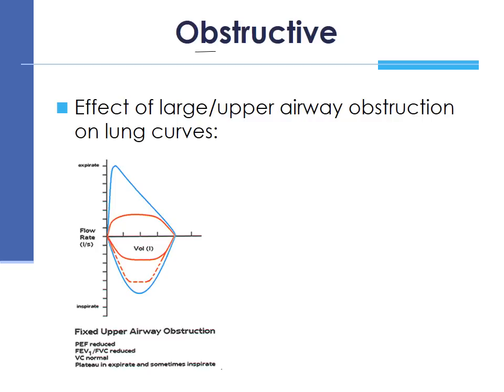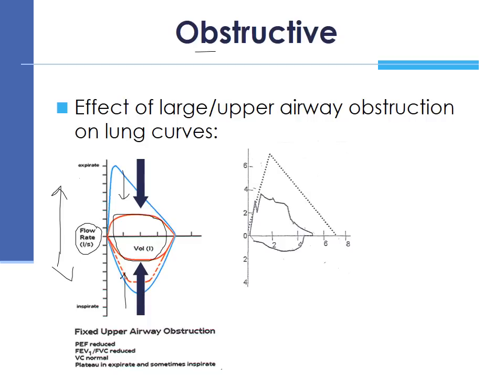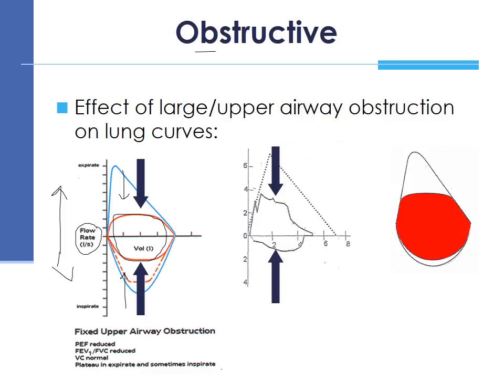And if we look at the flow volume curves that are formed for a patient with an obstructive disorder, we can clearly see that the flow volume curve has been reduced to this blob-like structure. That makes sense because we said that obstructive disorders influence the flow rate. And remember, flow rate is measured on the y-axis. So if there's a decrease in the flow rate because of this foreign object or the tumor that's obstructing the flow, it means that there will be a decrease in the graph size on the y-axis, thereby reducing the graph to this blob-like structure.